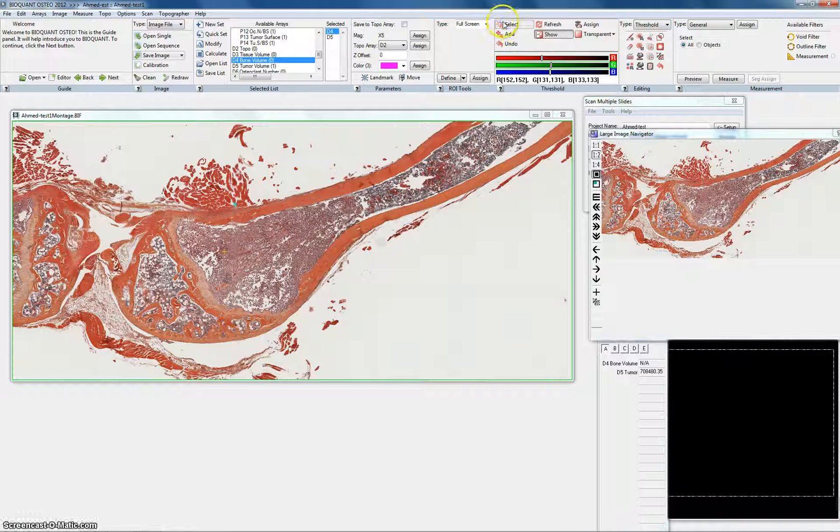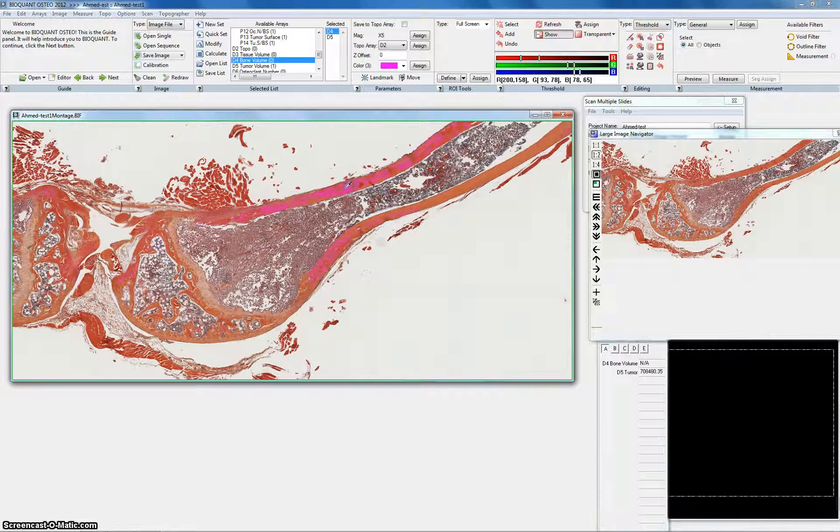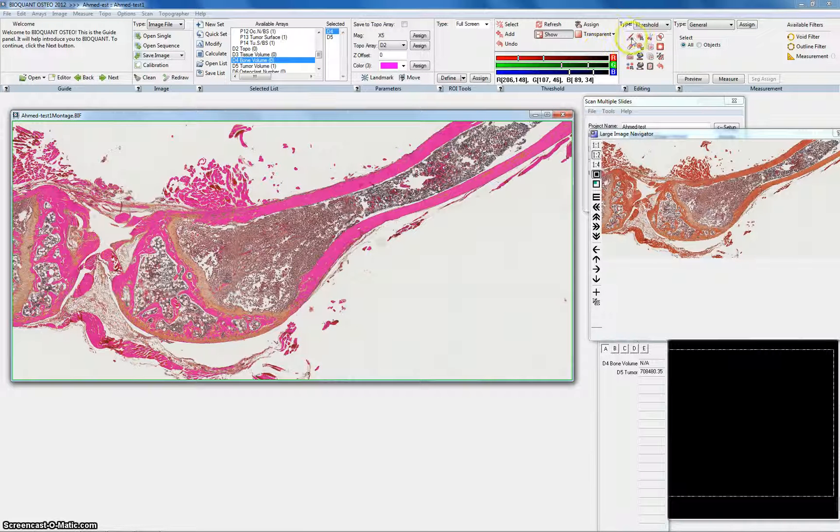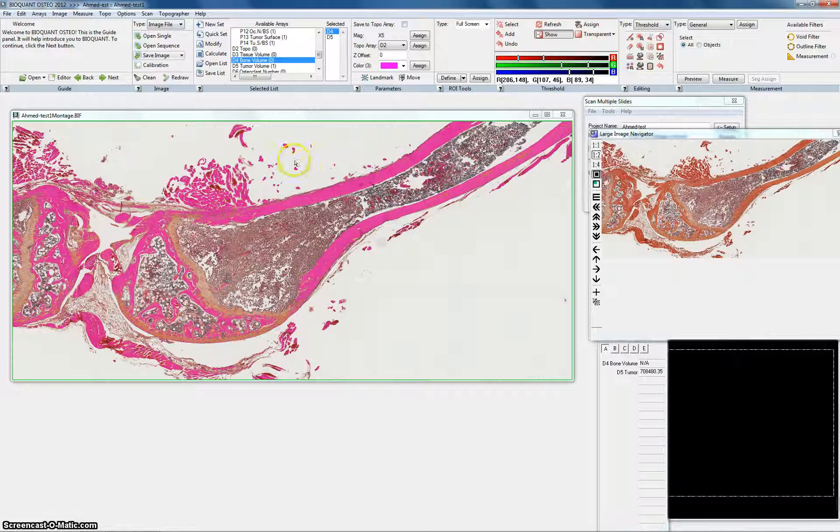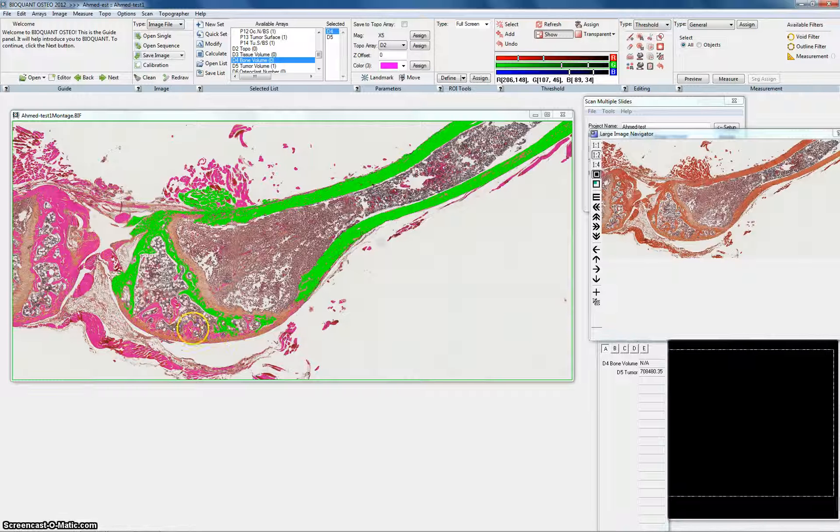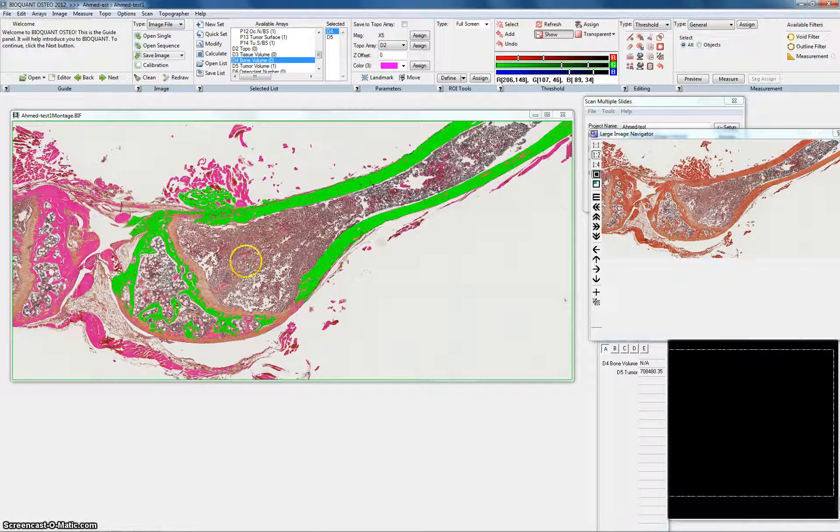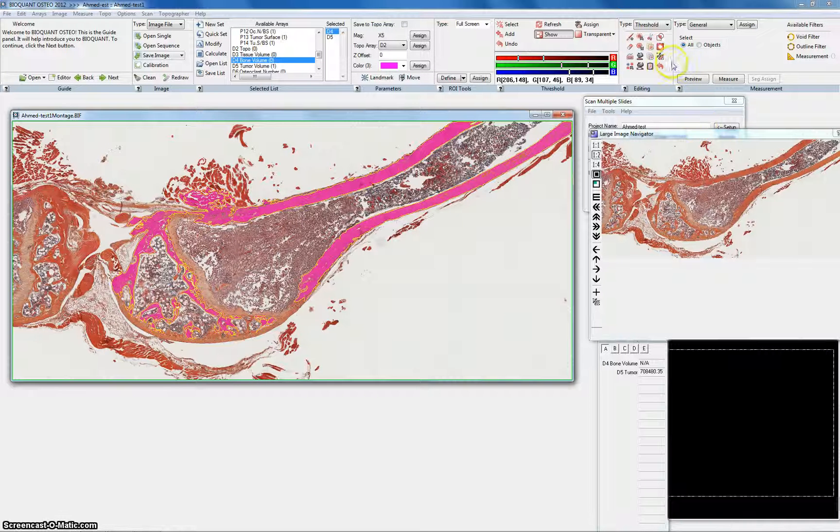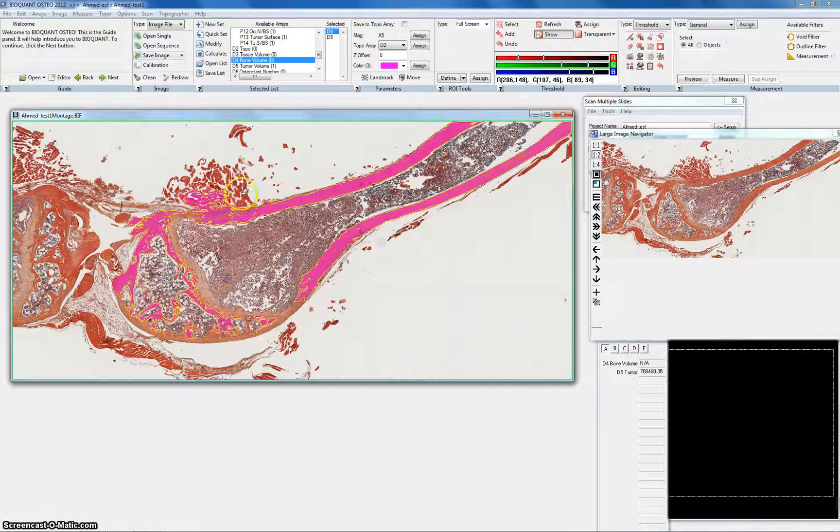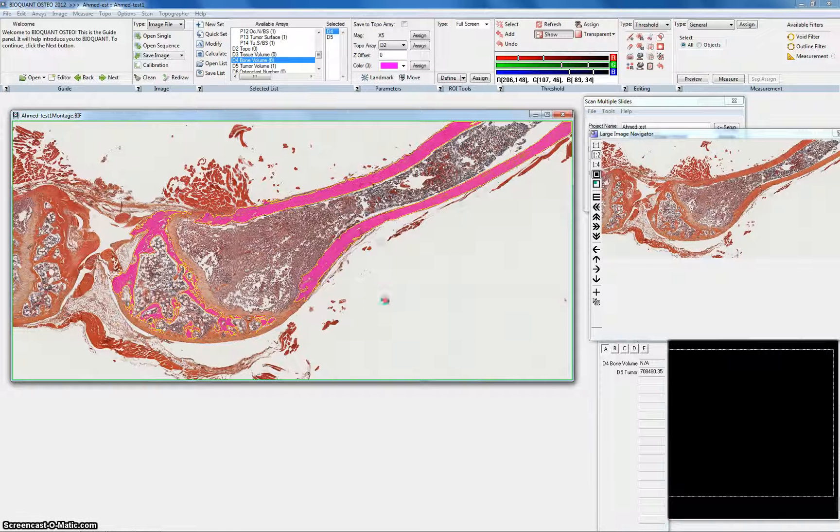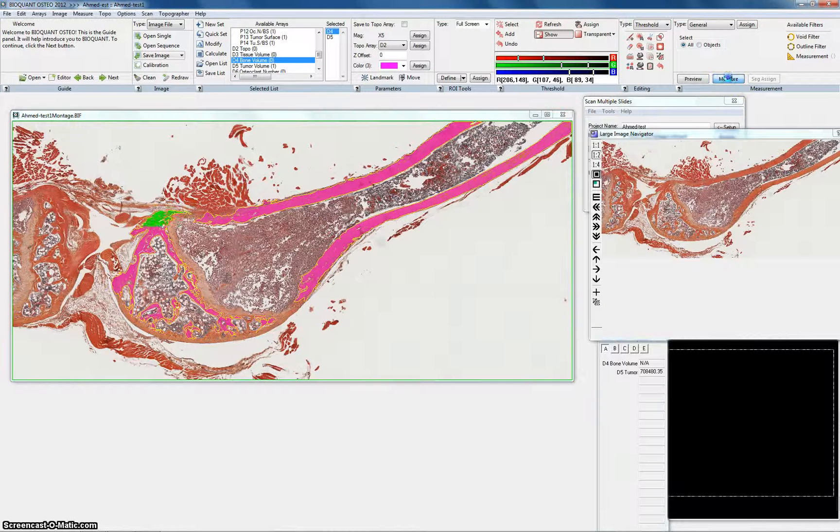To choose the bone volume you select thresholding. Thresholding comes very handy with the bone since it has its unique color. Now you could use only the bones in the femur without getting involved the bones in the tibia here. So you go to the selecting tool that I'm using and then you hit right click. It will deselect anything else. If you think I picked up some muscles because of similarities in color you could just erase it. Simple easy thing. And then you hit measure.